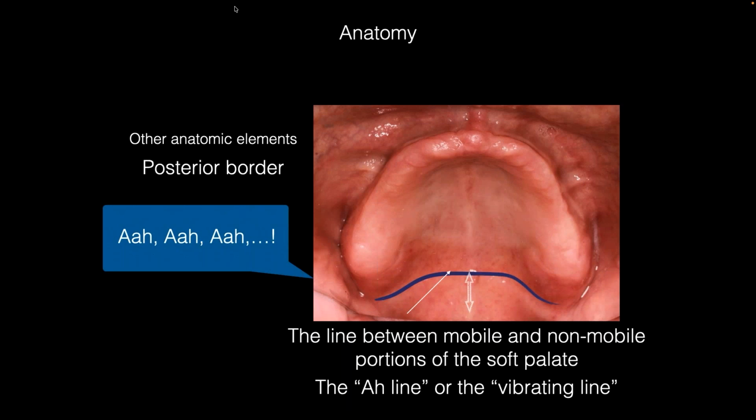That is the most posterior border of your denture in the palatal portion. If your denture is extended beyond that, as soon as the patient starts talking, the denture will fall down. If the patient is using a ton of adhesive and the denture doesn't fall down, it will create a nasty sore spot there, because that part of the palate keeps moving when the patient's talking, and it keeps hitting the denture. It's very uncomfortable. So we need to recognize that and capture it and transfer it onto our model, whether it's a digital model or an analog model.